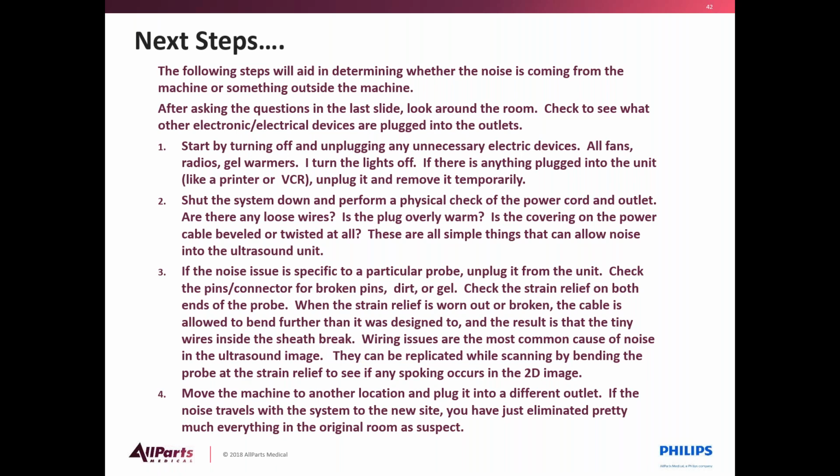If the noise issue is specific to a particular probe, unplug it from the unit. Check the pins in the connector for broken pins or dirt or gel or any other kind of debris. Check the strain relief on both ends of the probe. When the strain relief is worn out or broken, the cable is allowed to bend further than it was designed to, and the result is that the tiny wires inside the sheath break.